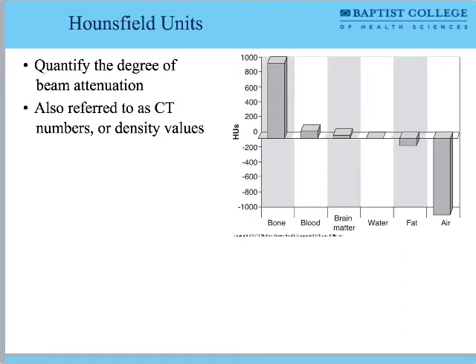Like I said, this is really only half of the story so far. We need to figure out a way to quantify that. That is the computer part of the tomography. The computer sees a lot more data in a CT image than you or I do. We have to work with the computer to see all the information that's in the image. So that's a big part of this class, is figuring out how we work with this computer to see everything that's there.